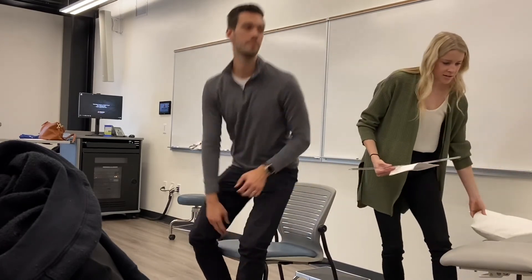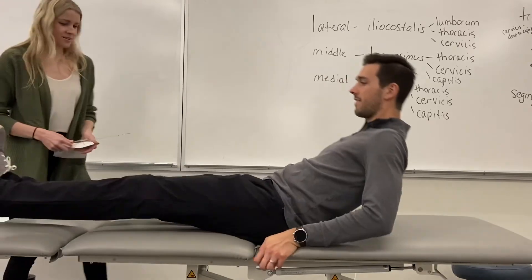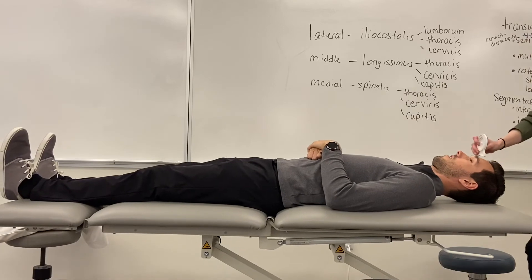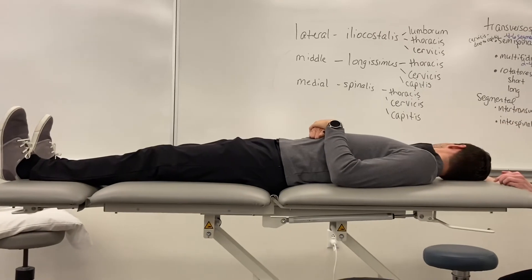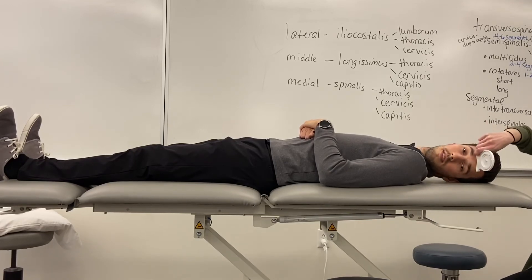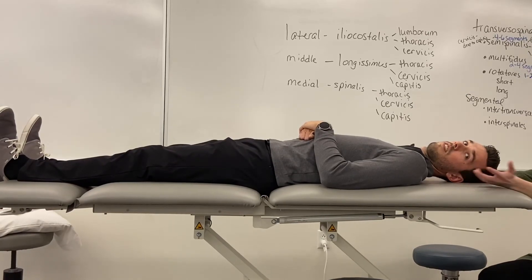For the inclinometer measuring rotation, your patient is going to be supine. You're going to put it on top of their forehead and set it to zero. Then he's just going to roll his head to one side — go ahead to the right. He gets 75. Then left — he gets 80. You can see there's a little bit of a discrepancy between the two measurements. It can be because in a supine position, his muscles are a little bit more relaxed, so he can get a little bit more range.